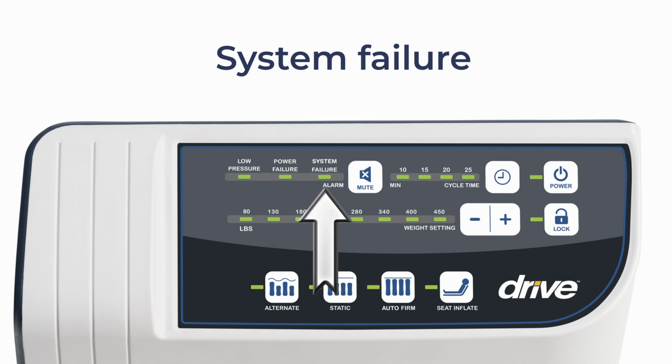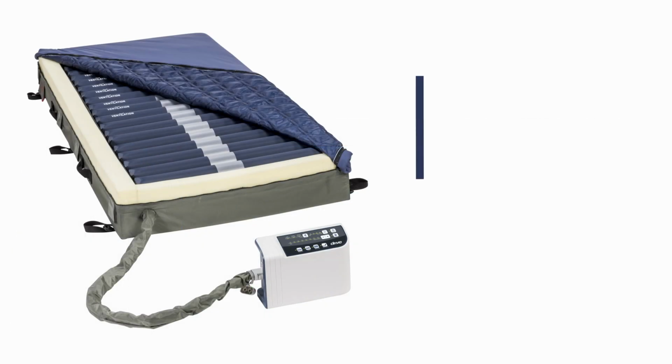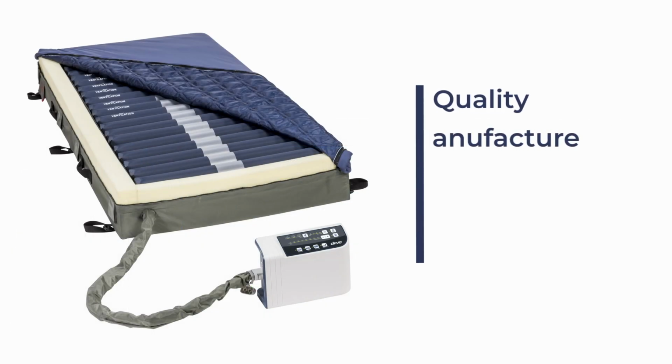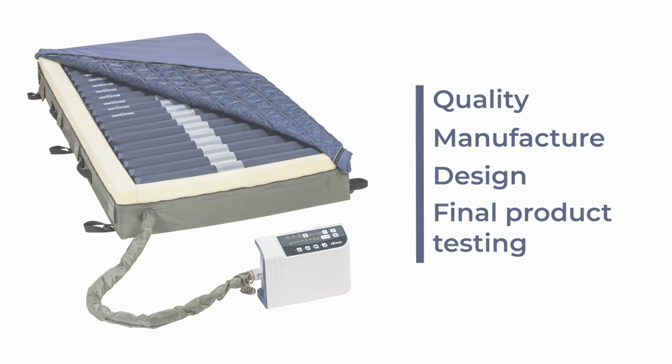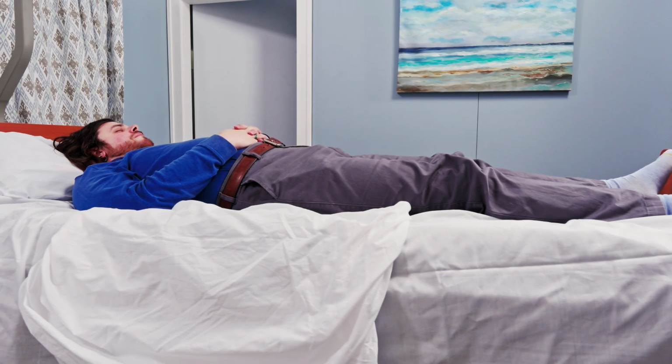The third alarm, system failure, means there's something wrong with the control unit and it'll need replacing. Rest assured, Drive DeVilbiss quality, manufacture, design, and final product testing are very rigorous, so these alarms will rarely sound. That's all there is to it.